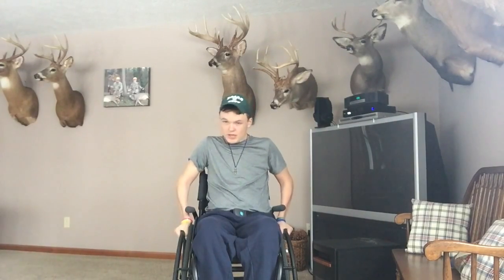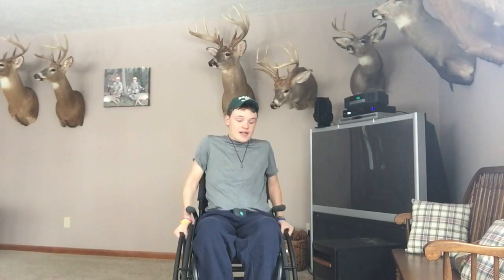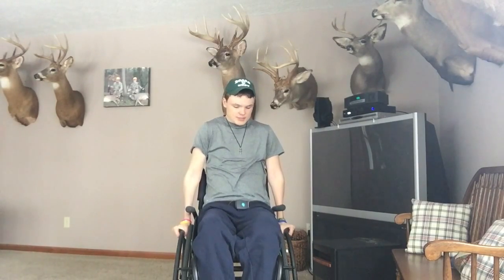This is probably how I do pressure reliefs most often. So what you want to do is put each hand on a push rim or tire and get your elbows next to these backrests or handles back here, and you just want to push down and try and go straight up and hold it there as long as possible. Sometimes whenever I do pressure reliefs like this, I do get a little bit lightheaded, and I believe that is because my blood is going to my arms, because my arms are being used pretty heavily.